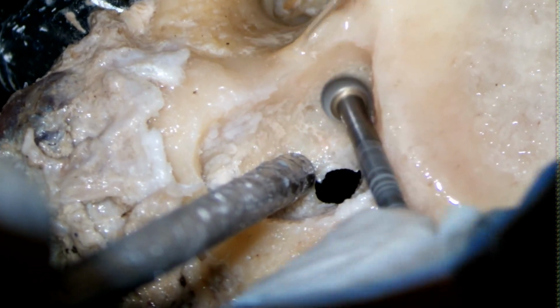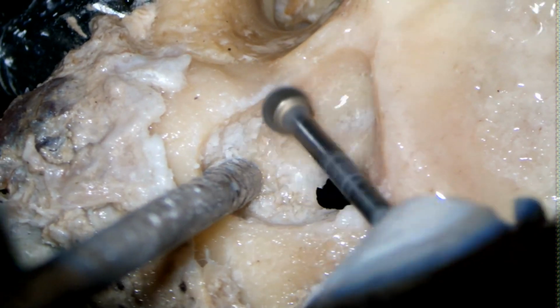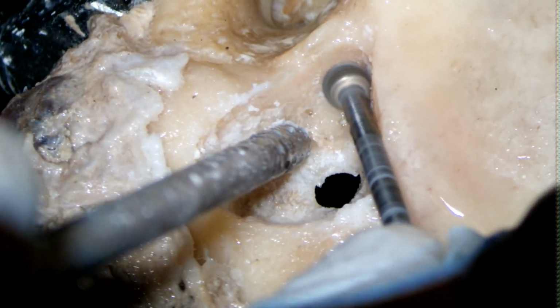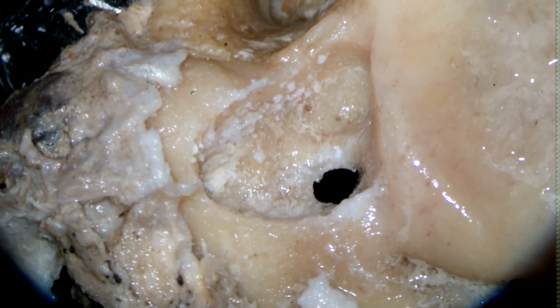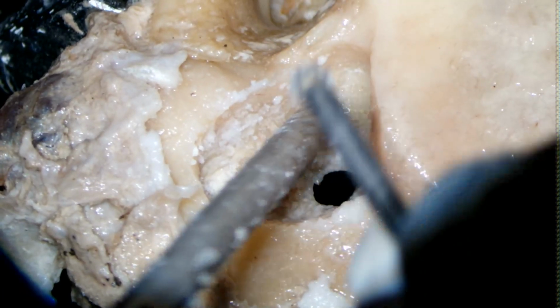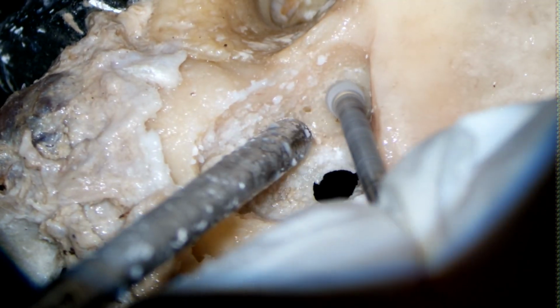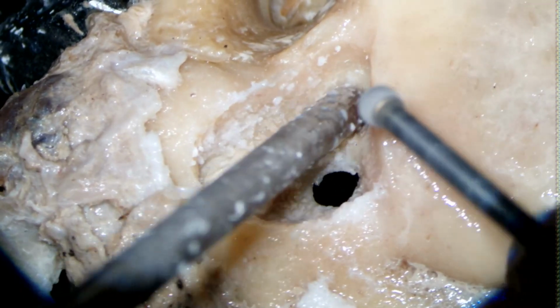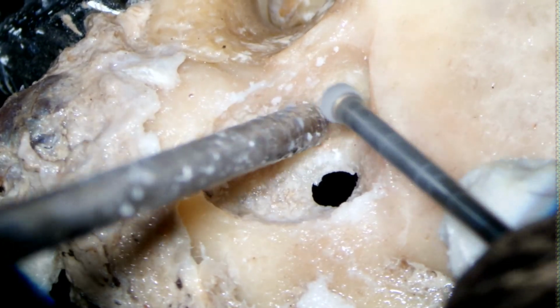So I think I will use a smaller burr now. Okay, so when you are doing a cochlear implant, in that case you have to actually thin the posterior canal wall, right? So simultaneously you can actually do thinning of the posterior canal wall. Again, in this patient, I mean in this bone, we have a very contracted antrum, so we are not yet able to find the antrum.